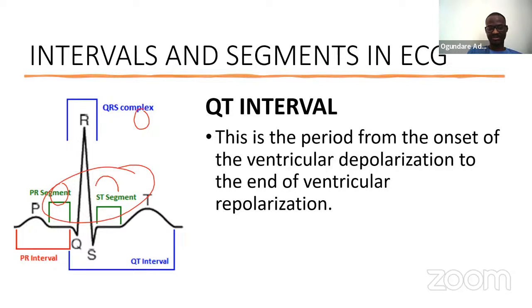T is the ventricular repolarization. So from the start of ventricular depolarization to the end of ventricular repolarization. Okay, that's the QT interval.